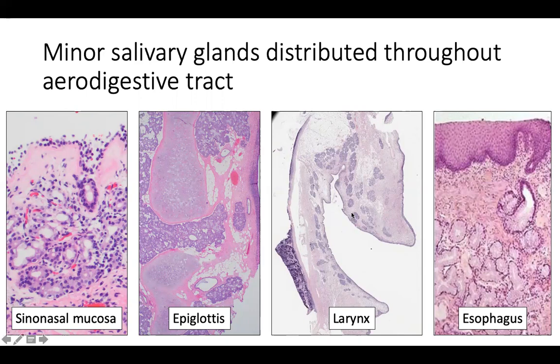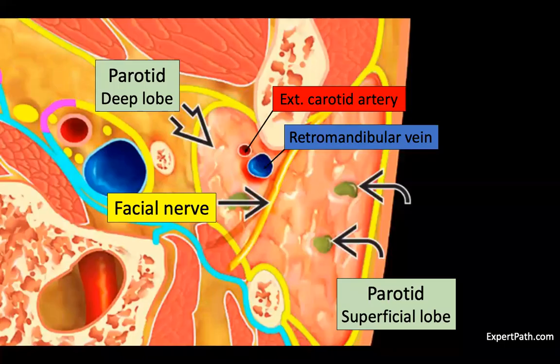And the false cord is absolutely lined with these salivary glands. So all these little grape-like clusters here are salivary glands. And then, like I said, esophagus also has some salivary gland tissue. So sort of distributed throughout, and that's what makes these sort of fun. Your colleagues from other subspecialties might be showing you lesions because they're worried about salivary gland carcinoma.